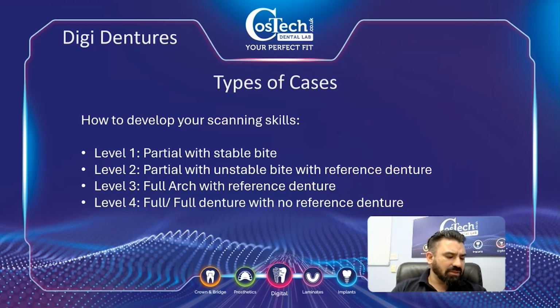A little tip, something I've learned recently, which definitely happens with 3Shape and a couple of the other systems: when you're scanning and it registers the bite, it gives off a little chime to say, yeah, I found the bite. Ignore that and just carry on going. When you're scanning the bite, start distally and go as far as you easily can, and then on the other side, distally and back. Even if it says, yep, I've got the bite, it is always better to give a little bit more information.